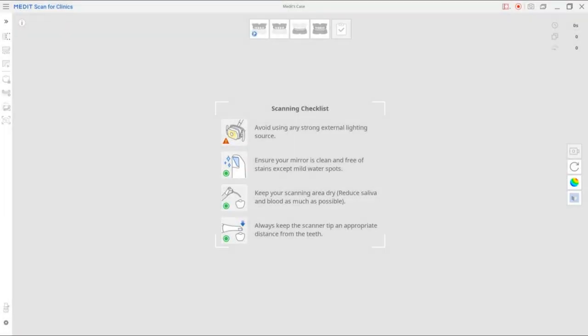In this video, we'll be going over the checklist for intraoral scanning. Good quality scan data requires precautions that are as important as scan strategies.